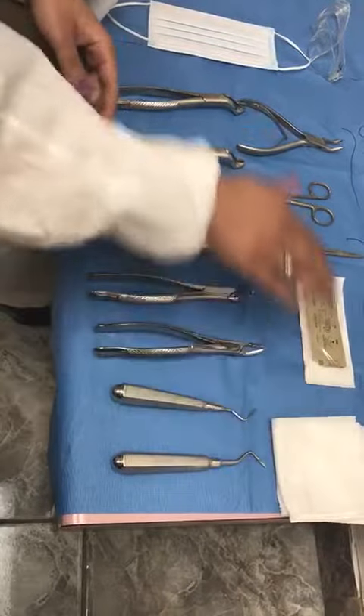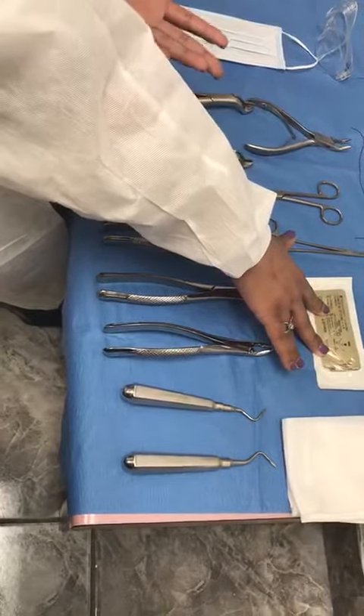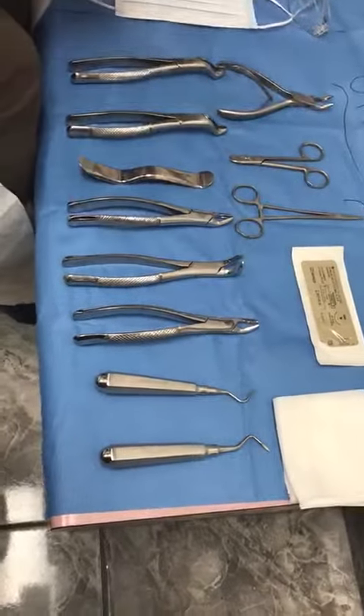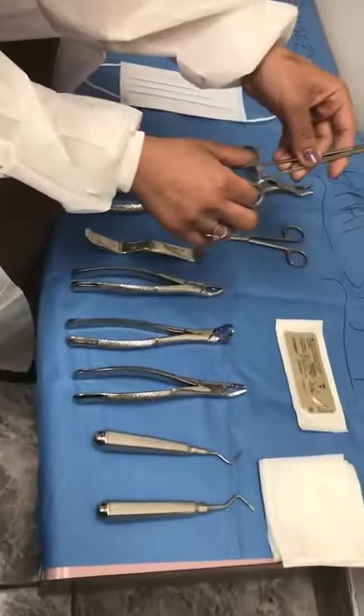This is to protect the patient. This here is a suture — generically people know that as stitches, but this is an actual surgical suture. This instrument here is a hemostat; it opens and closes.